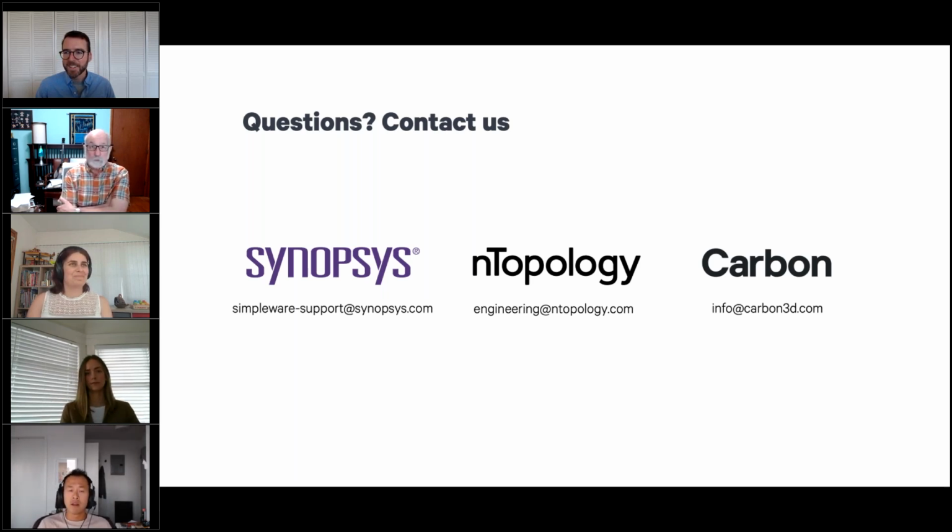Excellent. All right, and Steve and Allison, tell us about where the data lives. The data in our system lives in the printer. File arrives, it's processed in the printer. The only patient-related information might be a patient ID, but that's anonymized, so we don't get to know who the patient is. It's a simple number. So again, HIPAA is not broken in any of these processes.